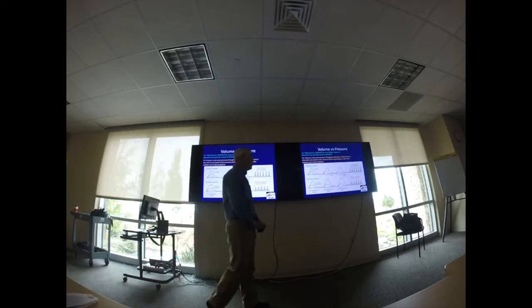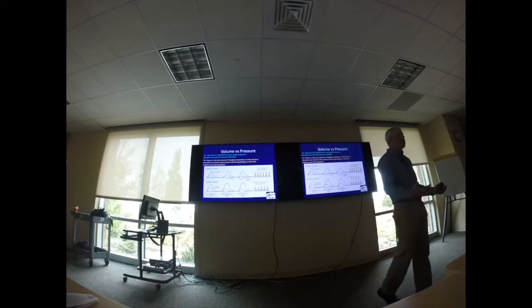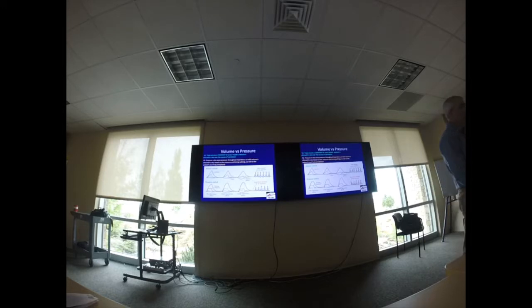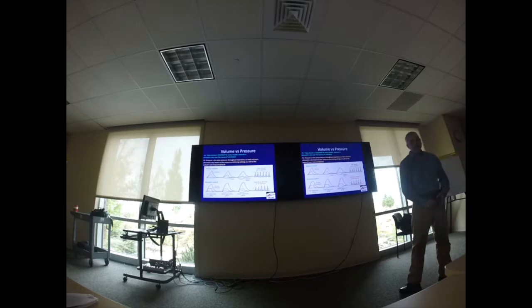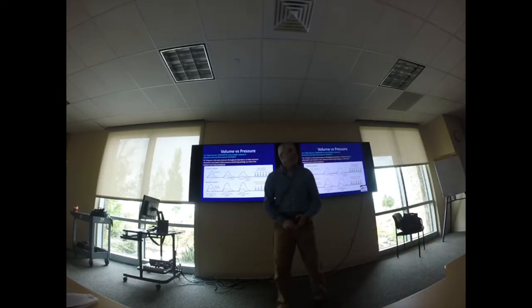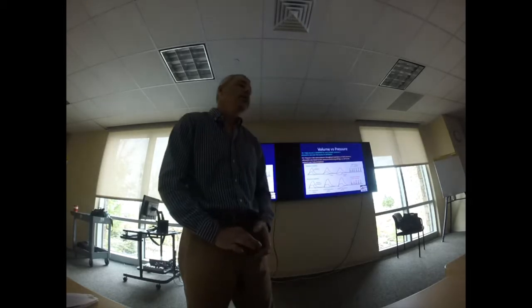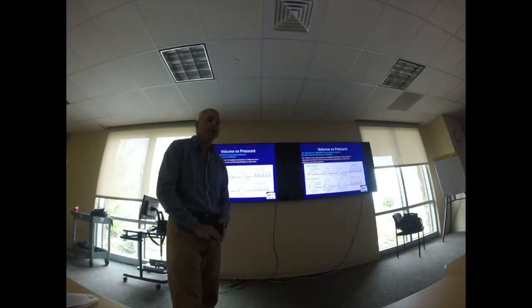What that means, you guys, is that if I set a volume on you, so we set a normal tidal volume, what are we going to set? 6 to 8 cc's per kilogram, right? We've got a 70 kilogram patient, so what's your tidal volume going to be? 560, right? So let's say we set a tidal volume of 500 on this patient.